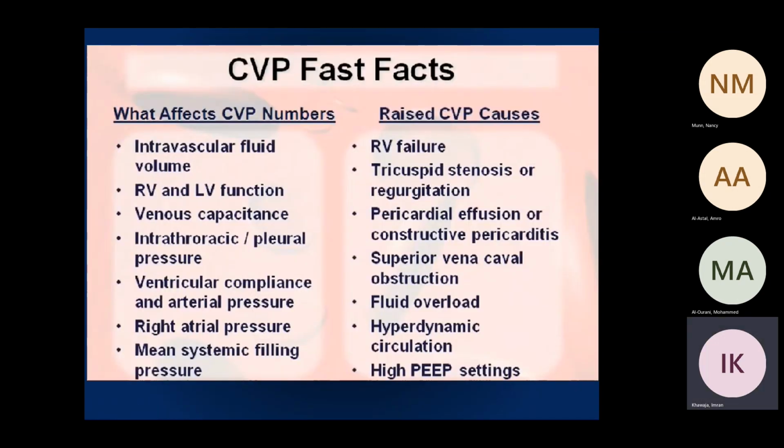Okay, like I said, CVP has limitations as far as assessing cardiac function or volume status. It is not the way to go, and that has to do with other factors that can affect your CVP.